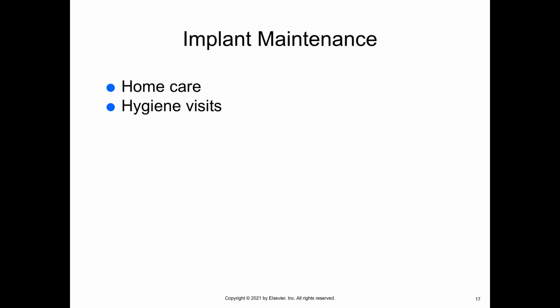Special instruments are used to clean the implant. They're made from titanium because titanium will not scratch the titanium implant components. When it comes to polishing, this is only to be done if deemed necessary. You don't want to use the fine, medium, and coarse paste because it can cause those tiny surface scratches, and when that happens, it allows plaque and bacteria to cling to the area. Tin oxide or non-abrasive polishing paste can be used with a prophy cup using very light pressure.